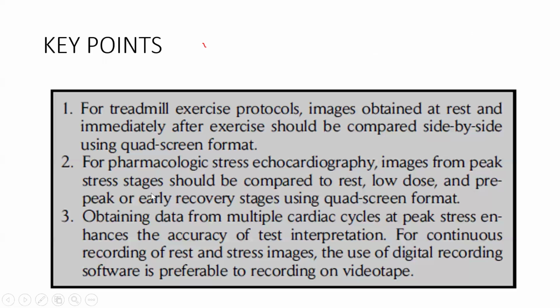viability. Now, this is from the American Society of Echocardiography 2020, their key points. They said for treadmill exercise protocols, images obtained at rest and immediately after exercise should be compared side by side using the quad screen format, which we showed. So you see the images in four views.